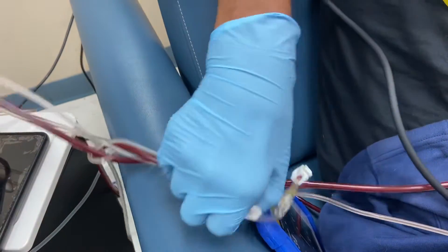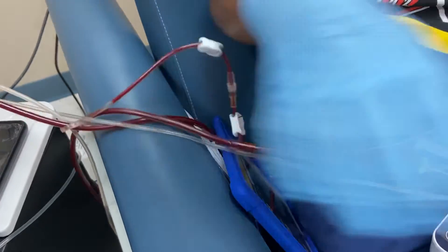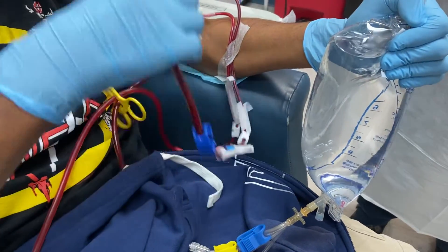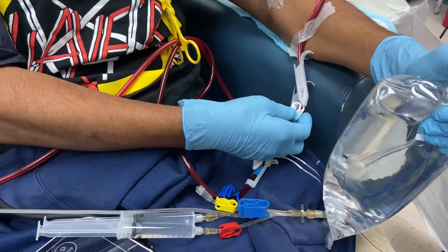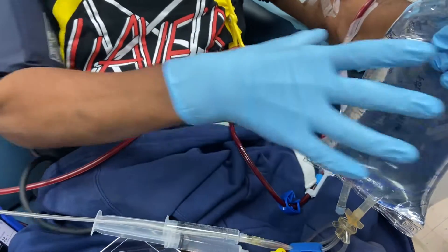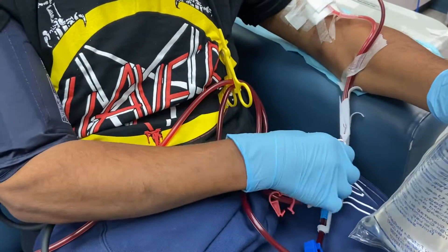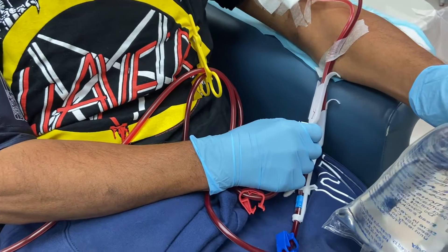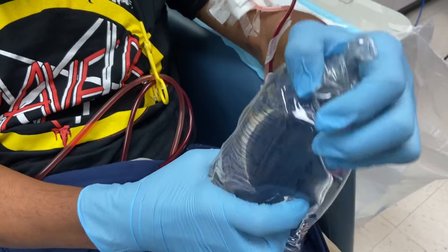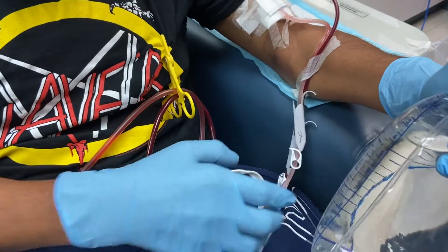So this is a solo patient. Start squeezing the saline, because if not, the blood will come back to the bed. So now he is rinsing the arterial line. Get your white clamp. The left hand squeezes the saline and the right hand is getting ready to close the clamp on the arterial line as soon as it's clear.